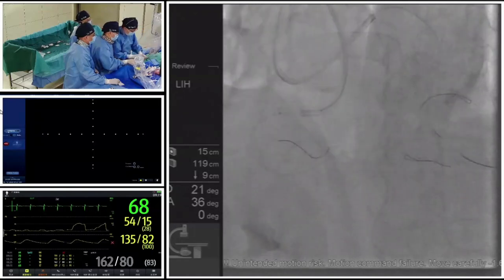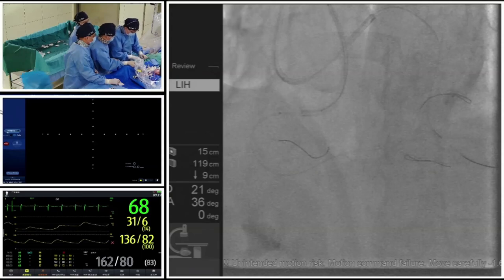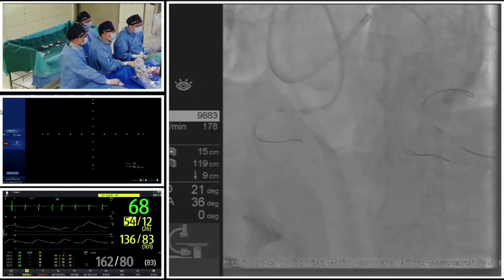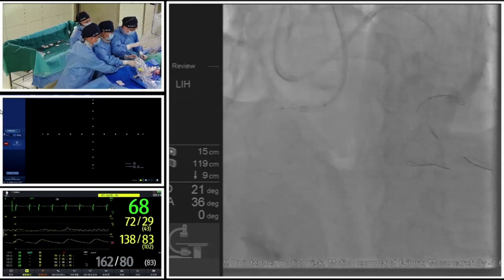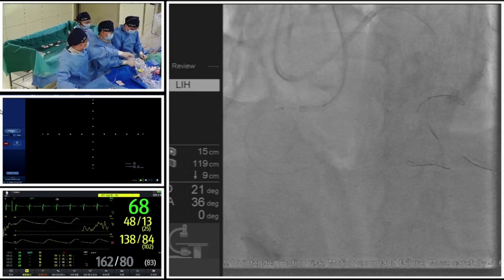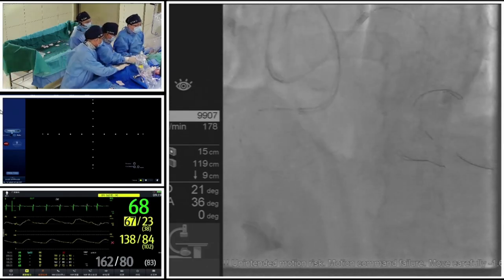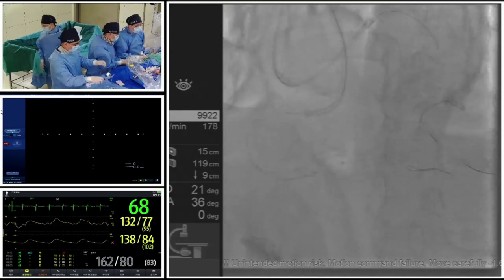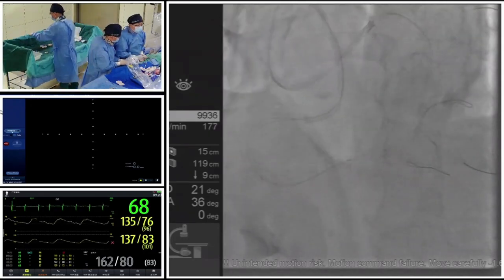Okay. Strong. That is strong. This is natural. Maybe sometimes we can see the polymer of the wire damaged after a long time of usage. All these kinds of balloons and devices on the surface of the wire may damage the polymer of the wire. So sometimes the delivery of some specific equipment could be troublesome. That is what I worry about, the rotation of the different wires.